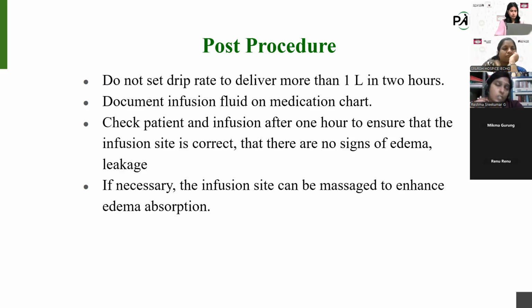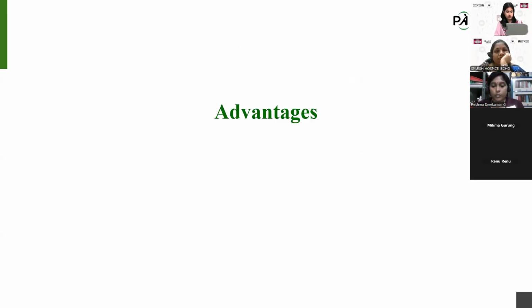If the infusion site is not correct, the patient may experience pain and edema. Check that there are no signs of edema, and check for any edema or leakage. If necessary, the infusion site can be massaged to enhance edema absorption. If there is mild edema and there is no pain, then we can give mild massaging on that area, and that will enhance the absorption of fluid. This is the post procedure.